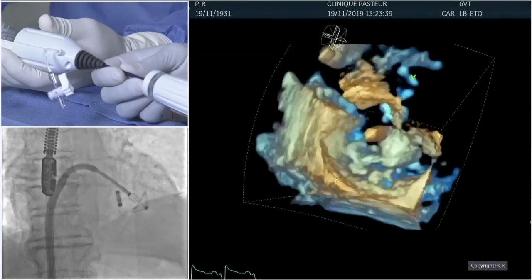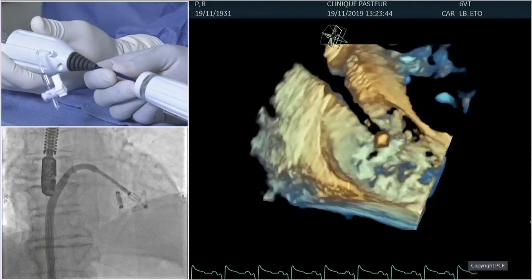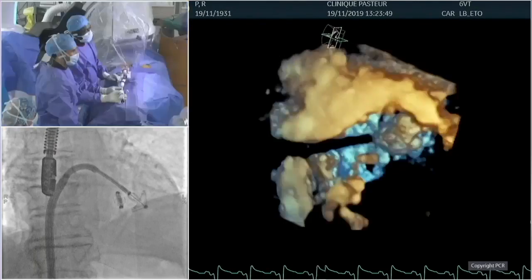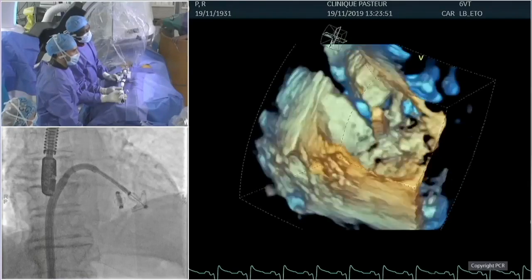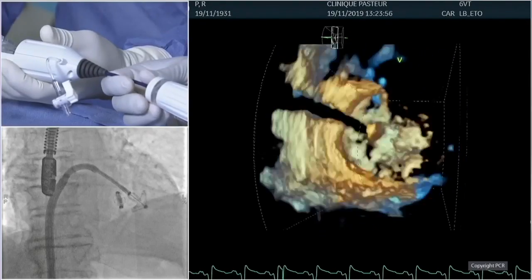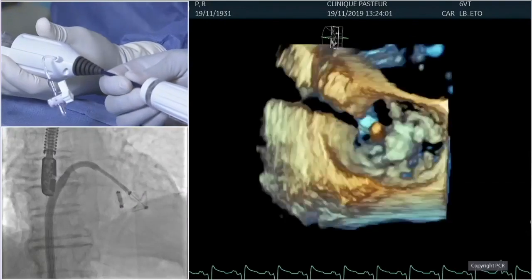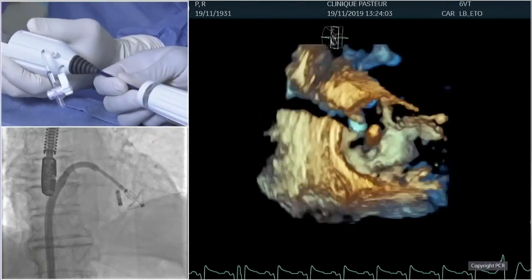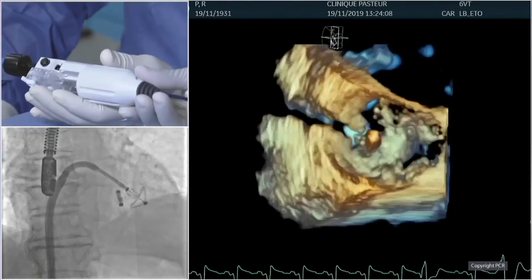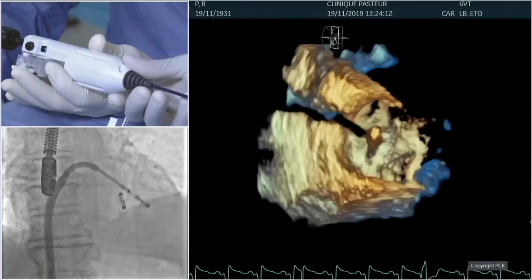Yeah, so we have to now put the cursor really on the second Pascal. So Philippe, it's not parallel with the first device. Is that a concern? Should you try to get it more parallel? Yeah, in most cases, if the second device goes next to the first, then it should be almost parallel. So if imaging on echo is difficult here, I would focus on fluoro and try to get the same orientation. Mettons en fluoro. Okay, we're going to use the fluoro. Maybe more like that. Okay.